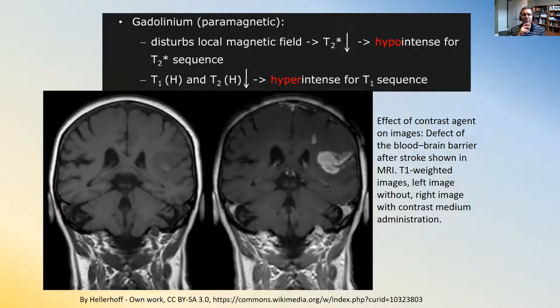And sometimes, there are some structures in the brain that are so subtle you can't see them at all. So it's not at all uncommon when you undergo a scan for the nurses or technicians to actually hook up an IV to you, intravenous drip. And within that IV, there could be a paramagnetic substance. We call that a contrast agent. So they are intentionally going to inject something very dilute, but it is magnetic. So remember I told you before, having anything magnetic in you is bad. This stuff is so dilute, it's not bad, but it is magnetic and it's easily visible on an MRI.